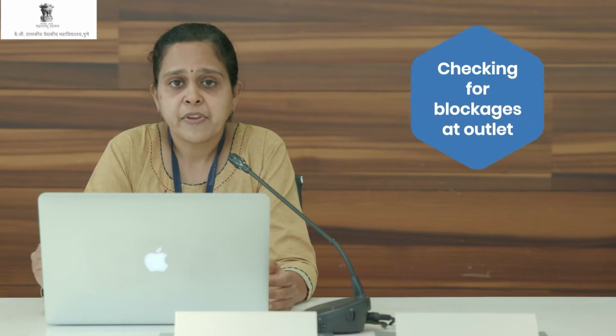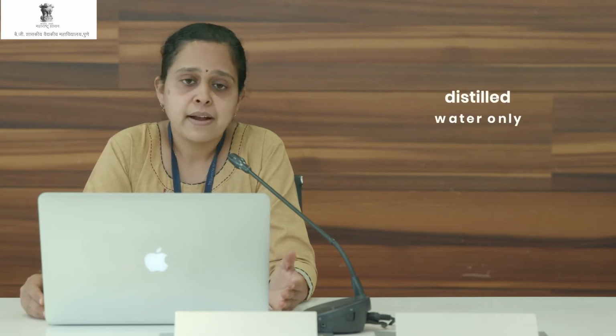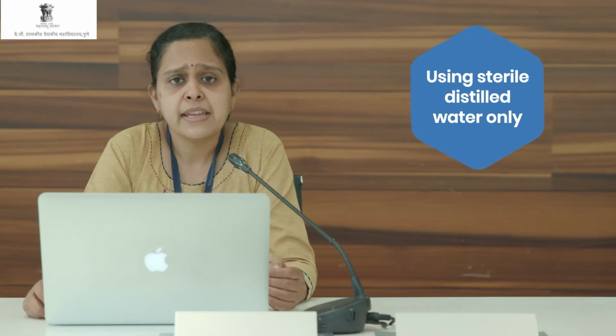So all these can be prevented by regular cleaning of the humidifier bottles, checking for the oxygen flow, checking for the blockages at the outlets of these flow meters, using sterile distilled water only for filling the bottles, and checking flow meters for any leakages. All these should be a part of the working protocols of the staff nurses, and one day should be assigned in a week to maintain all these protocols. If at least once or twice a week all these checklists are signed, then we will surely be able to reduce the incidence of mucormycosis.